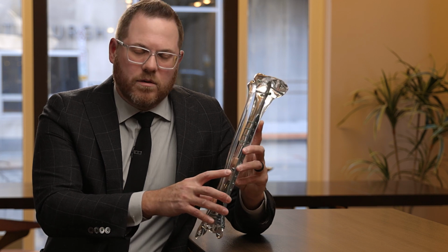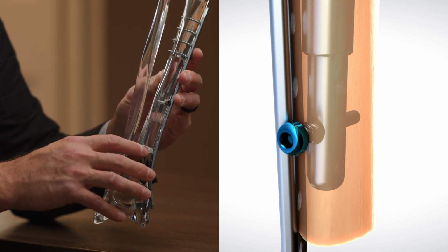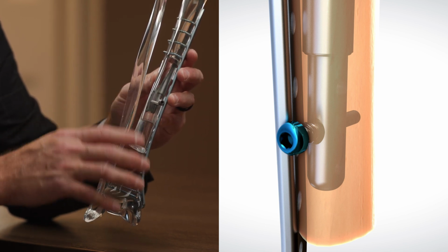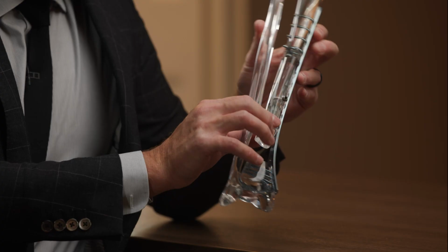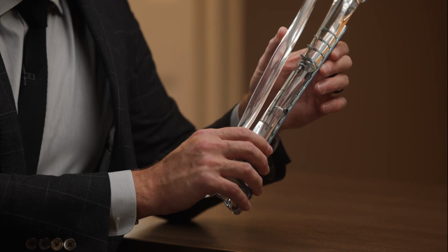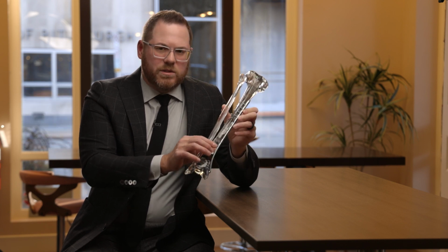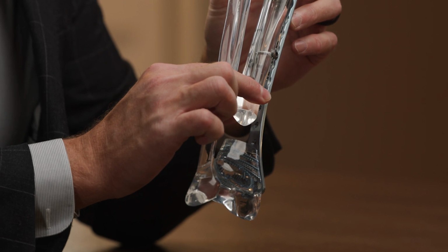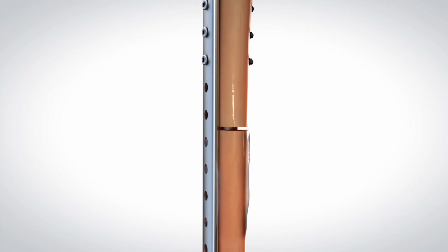Here you can see the distal crosslock screw, and prior even to placement of the intramedullary nail, the surgeon will have created a low-energy osteotomy. And here you can see that osteotomy. The surgeon would have performed this based on the plan and a series of measurements. That osteotomy is performed under low energy, low heat, and this will be the segment that over the next weeks to months will be transported, in this case from proximal to distal.